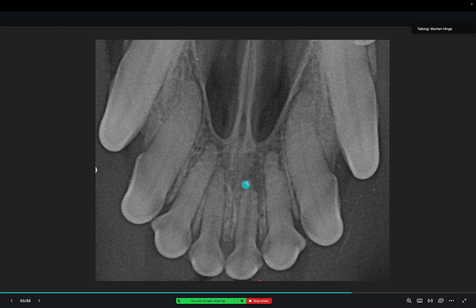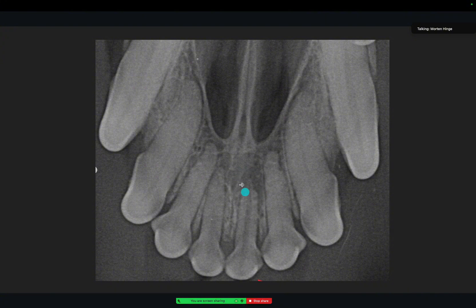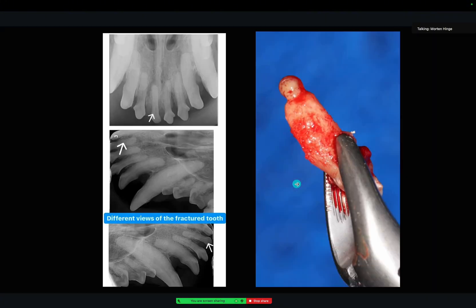And the root — where's the root tip? It's gone, it's resorbed. So this is definitely a pathological lucency.